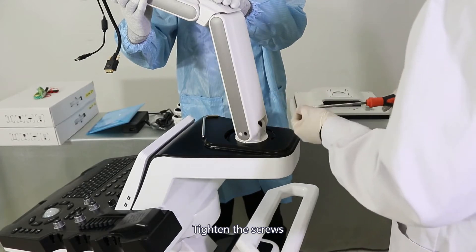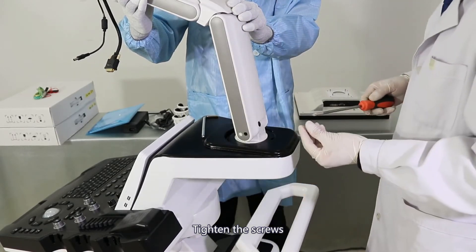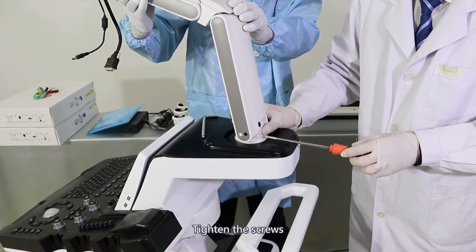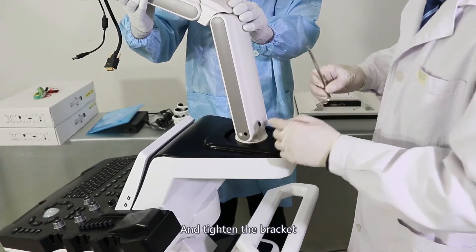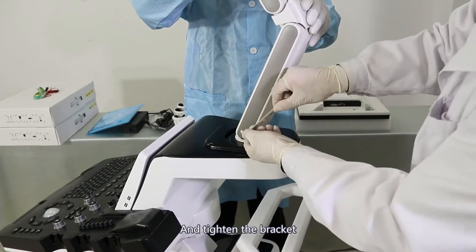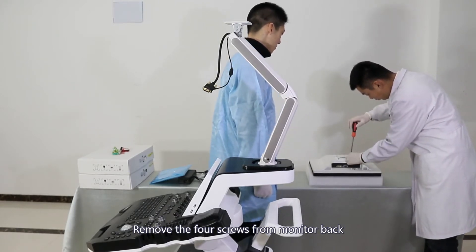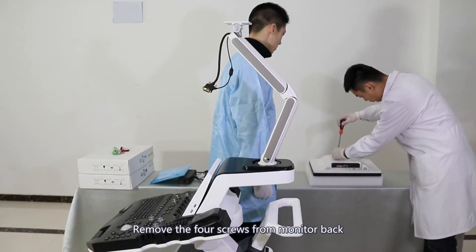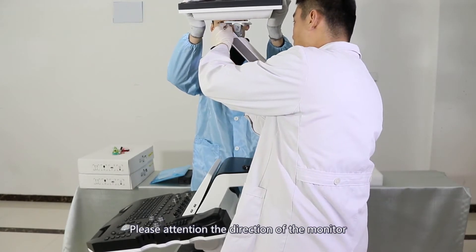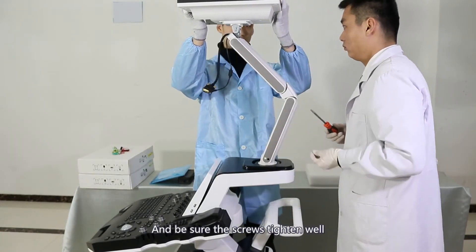Tighten the open brackets and lock the right side of the bracket. Remove the four screws from the back of the monitor.